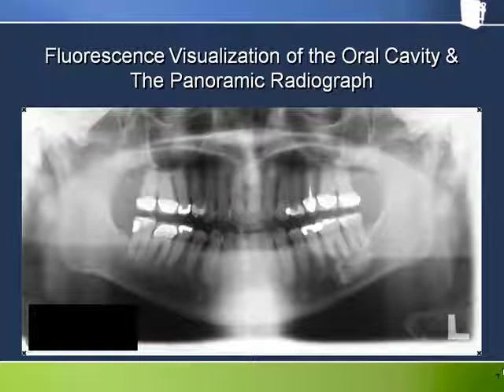This additional radiographic view is beneficial to facilitate investigation of disease that is not readily perceived by the human eye. For example, a vertical bite wing for evaluation of bone loss in periodontal disease, or radiolucence of interproximal regions for dental caries.